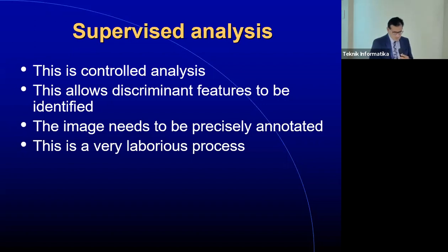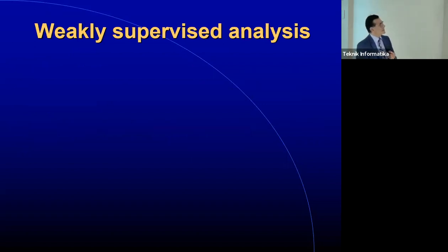Okay, well, let's say we don't want to do this because we can't find a pathologist. I'm not going to talk about unsupervised, where you just throw it in and you're away for a class distinction. But let's say we're going to do weakly supervised analysis. And here, all we would do is take a series of slides from diagnosis A, and a series of slides from diagnosis B.